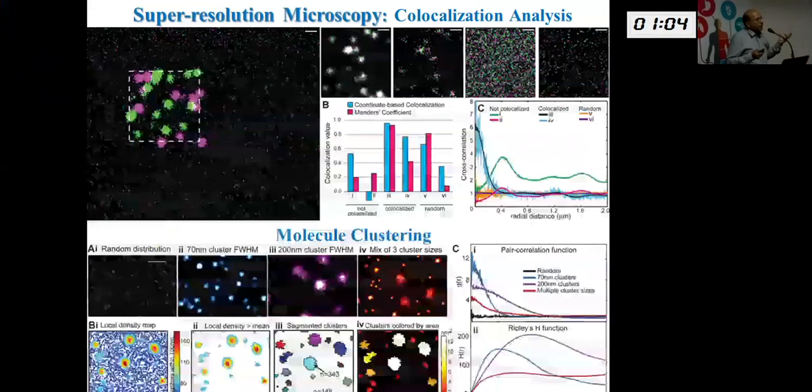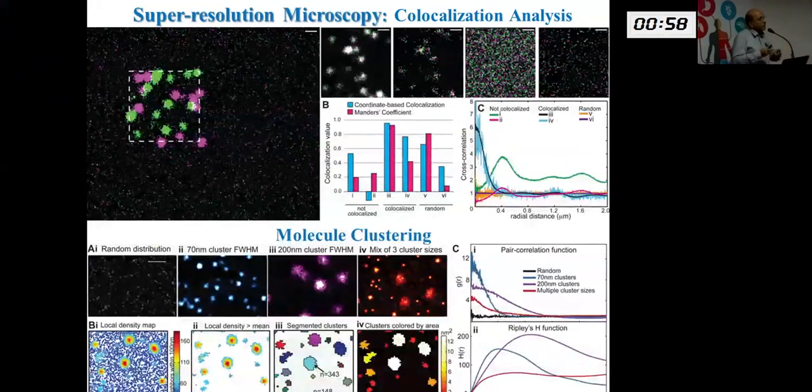Now, having two molecules of interest in a tissue does not mean anything. Even if they exist close by, it could be a random chance that you may have found those molecules together. But as you can see here, how do you know this? Computers, with their ability from past tissues and algorithms, can actually count how often these molecules, by size and stain, are co-locating. Is it by chance? Is it by a random movement or presence? Or is it truly, as you can see here, present at a much higher ratio, indicating likely etiological association?